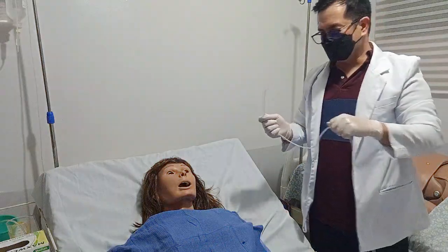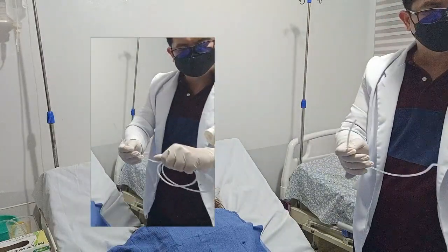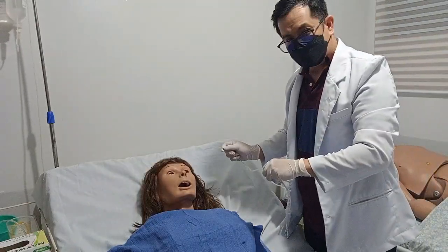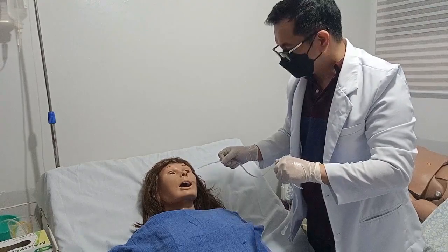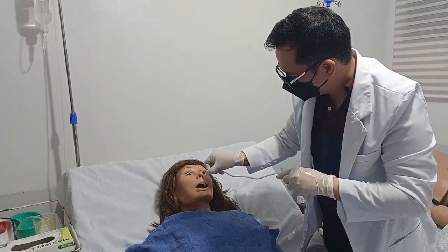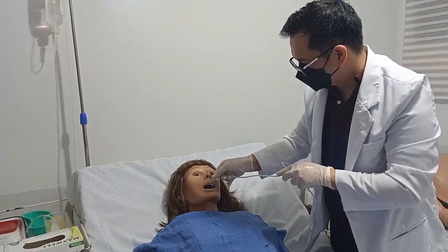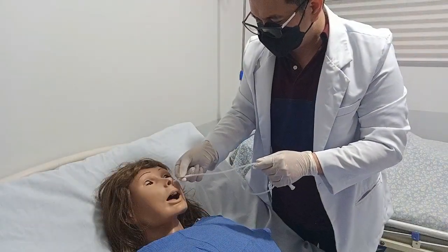Insert the tube. Lubricate the tip of the tube well with water-soluble lubricant or water to ease the insertion — you can ask somebody to help with lubrication. Once done, insert the tube with its natural curve toward the client into the selected nostril. Ask the client to hyperextend the neck and gently advance the tube toward the nasopharynx. While inserting the tube, ask the client to swallow. If the gag reflex is stimulated, use water and ask the client to sip some water. Insert the tube to the markings you have made.